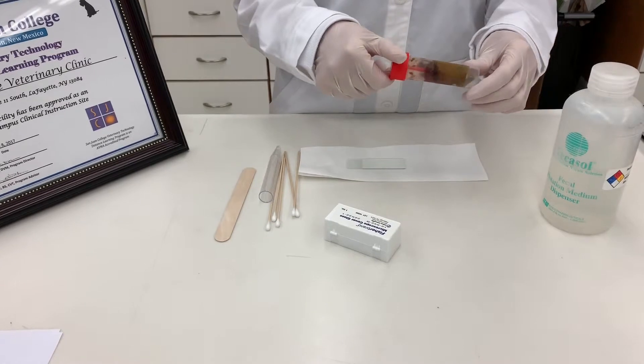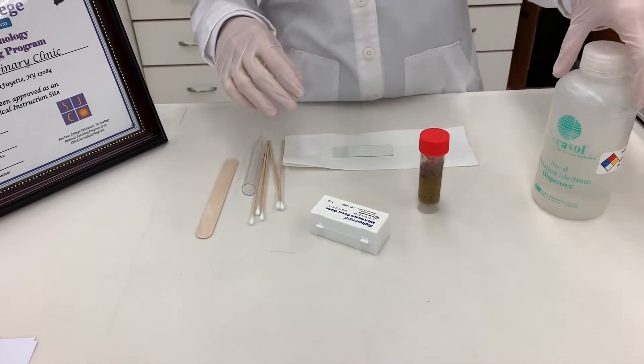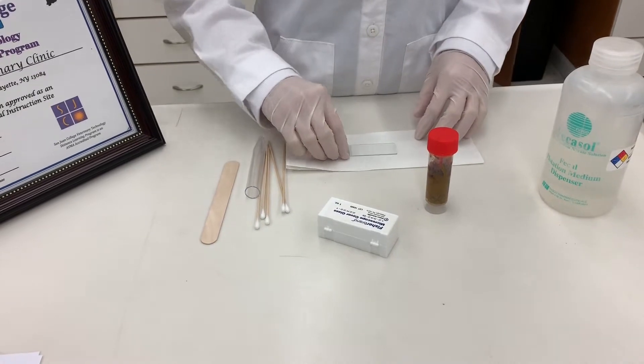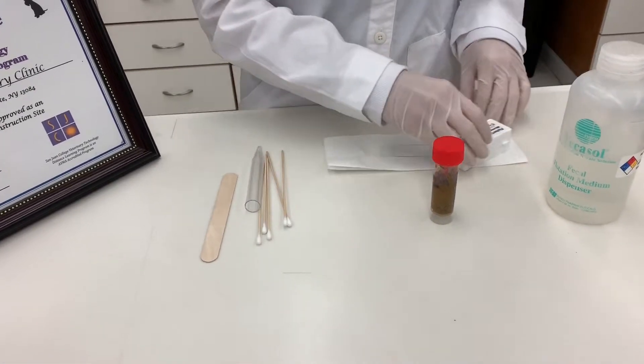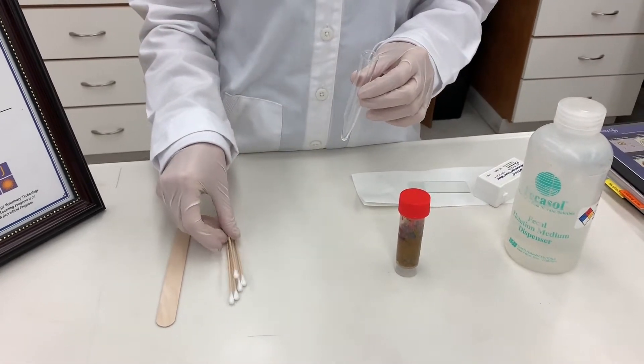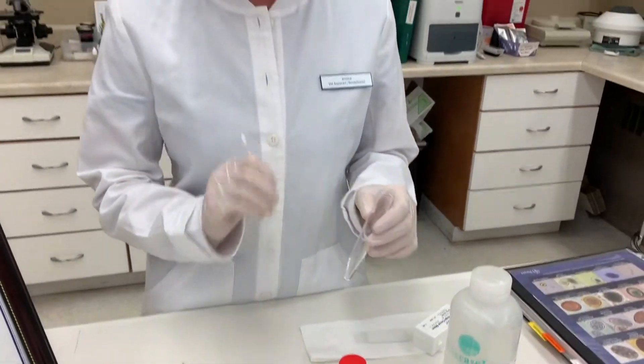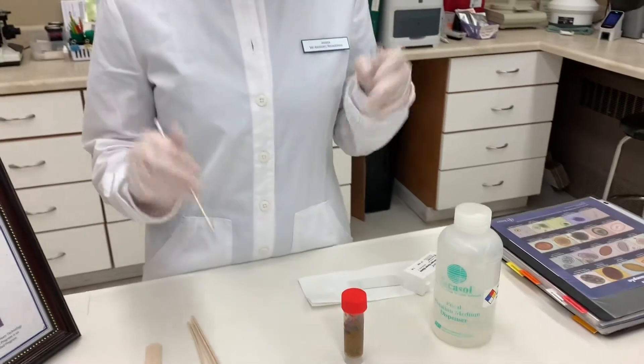I do have my fecal sample properly labeled with the patient's name here. The supplies are the fecal sample, a microscope slide, cover slips, and a centrifuge tube with applicator sticks, which we're going to use to take the feces out and put it in the tube. So let's get started.